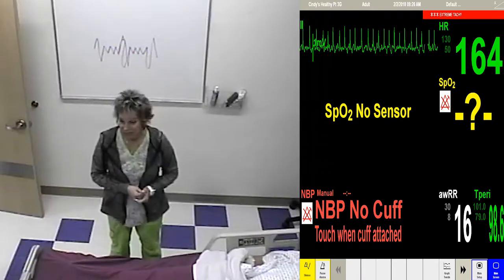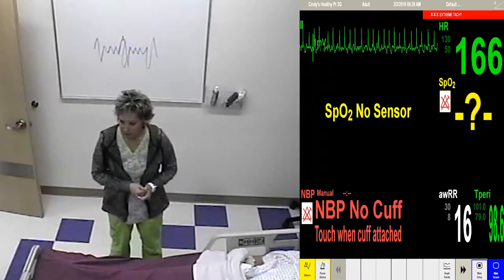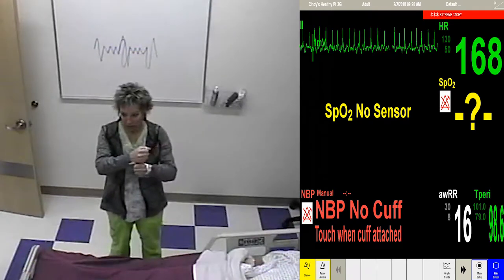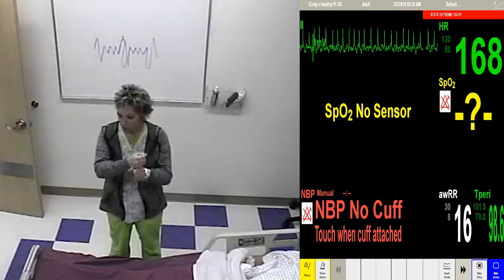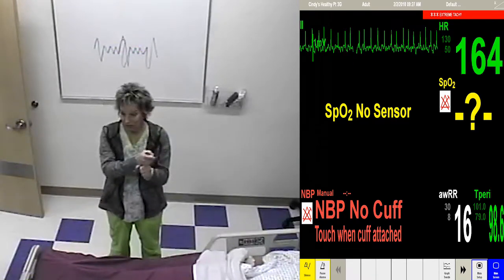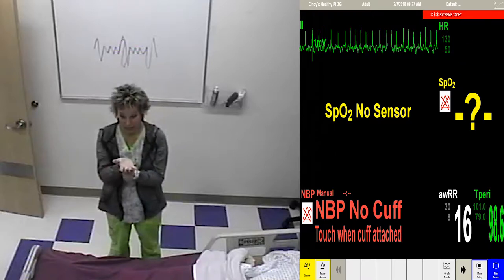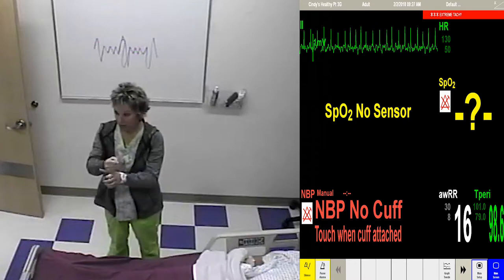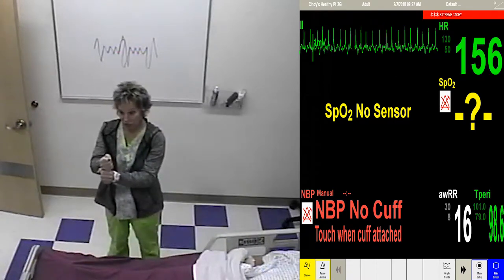Now, it's not regular, but it's not bad, right? So your heart, QRS, pump. Okay? So your ventricle is pumping, but your atrium is not. It's fibrillating. This is atrial fibrillation. So normally, pump, pump, pump, pump, pump, pump. But in atrial fibrillation, you've got more of this.